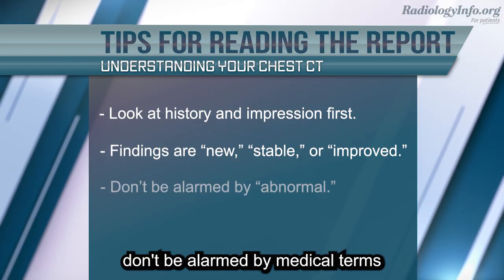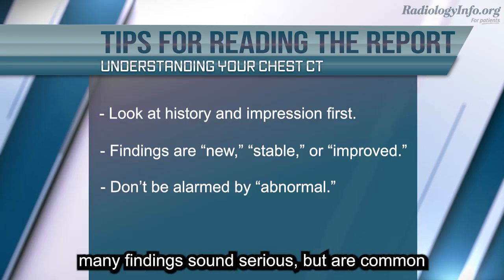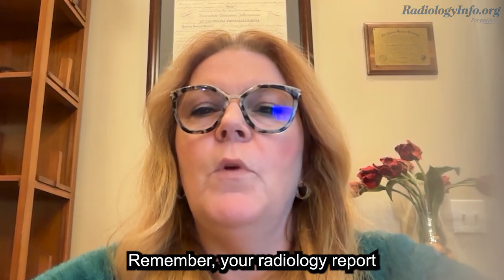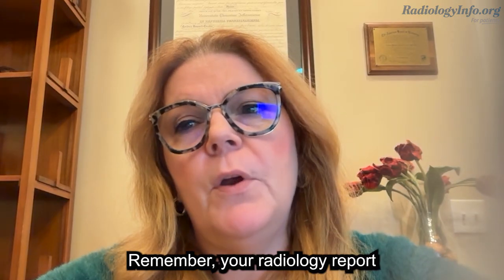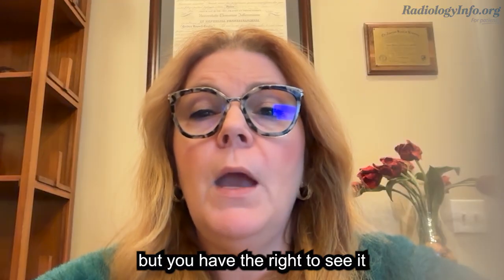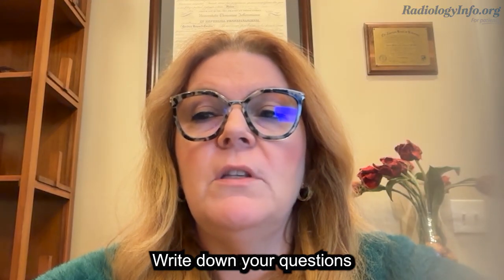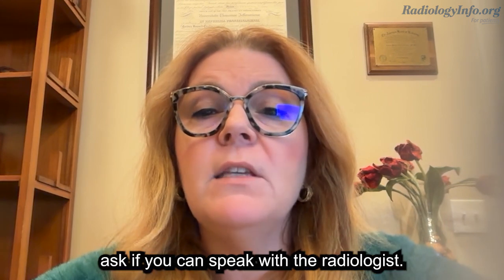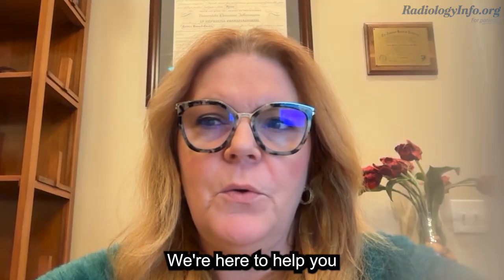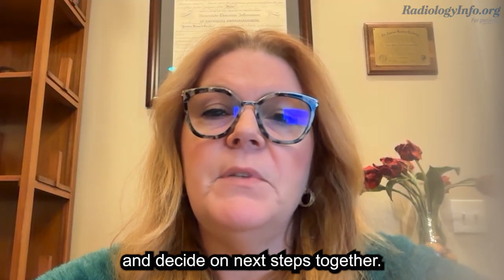Third, don't be alarmed by medical terms such as abnormal. Many findings sound serious but are common and not dangerous. Remember, your radiology report is written for your healthcare provider, but you have the right to see it and understand it. Write down your questions and talk to your doctor or ask if you can speak with the radiologist. We're here to help you make sense of your results and decide on next steps together.